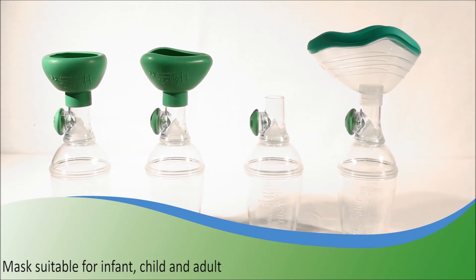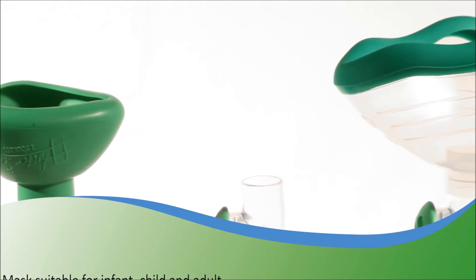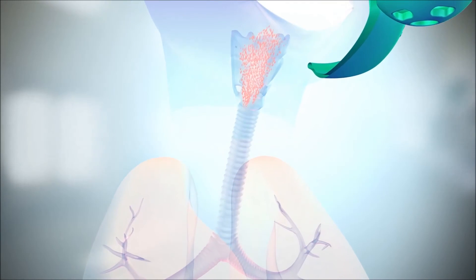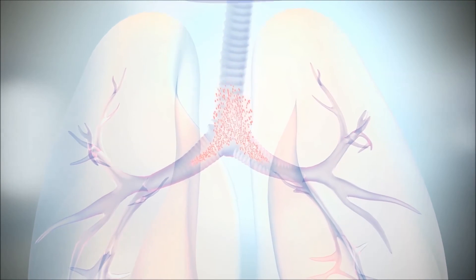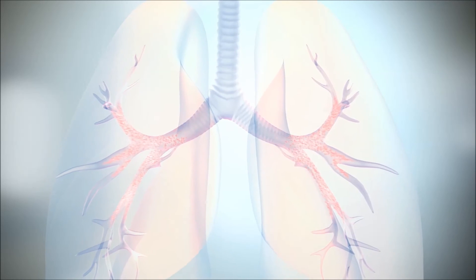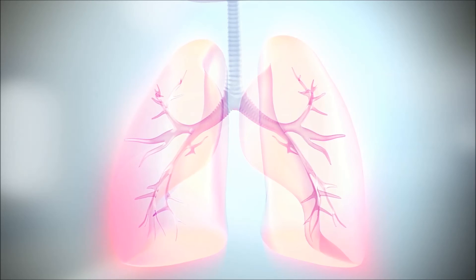Various mask models are available to fit every patient's needs. Your doctor prescribed a chamber adapted to your medical treatment. This chamber is part of your treatment. Make sure to use Tipshaler as recommended by your healthcare professional.